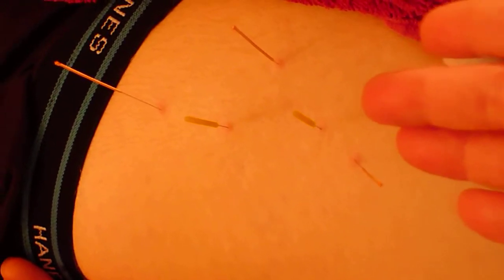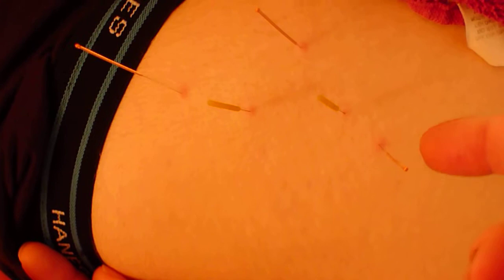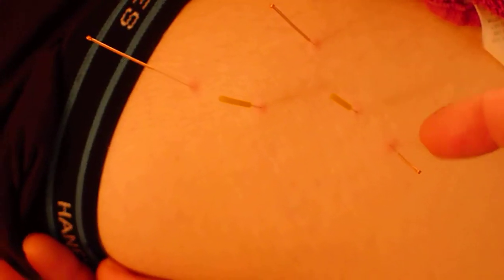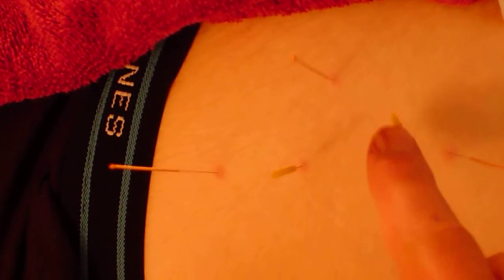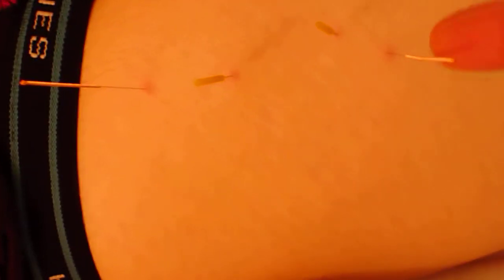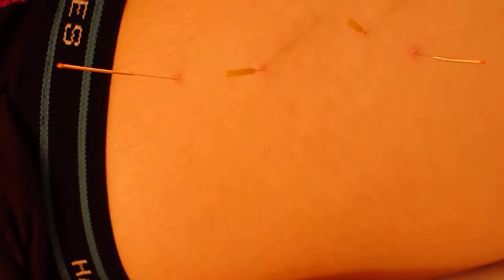And then I've done dry needling — these are actually three-inch needles right here. I've released his piriformis very well, as well as his quadratus femoris. With the piriformis, I've needled directly into it, but then I've also come in at an angle to get different fibers of the muscle, and that's a technique that's very helpful.